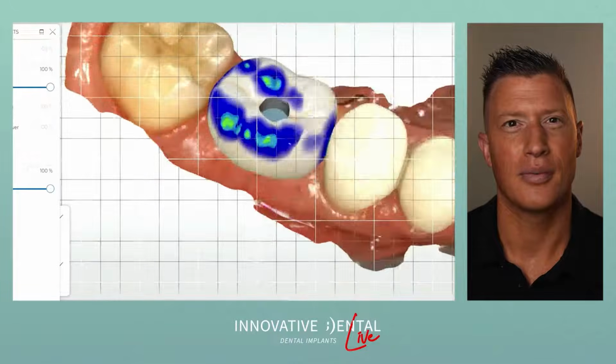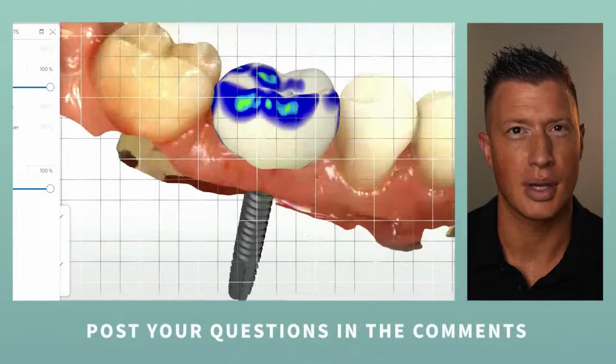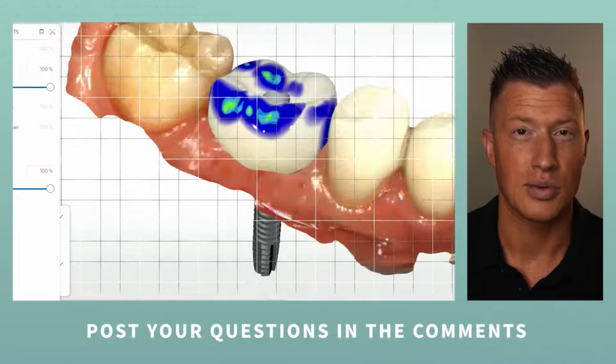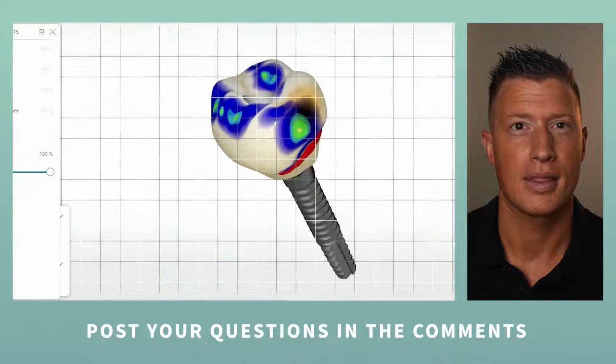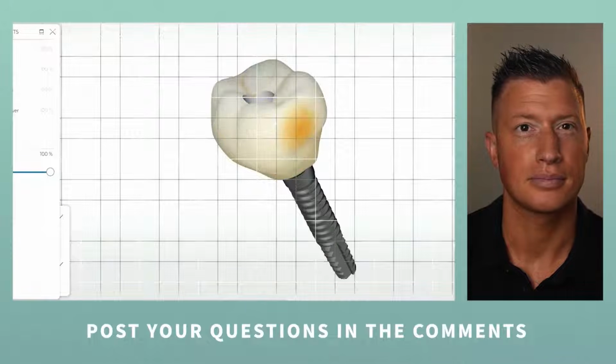So finally, just getting those marginal ridges, like I was telling you about, we want to match those up the best we can. And that's what I'm doing there. Make sure our contact is broad enough. That's what I'm doing there.